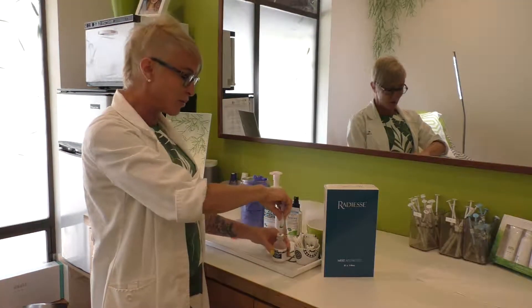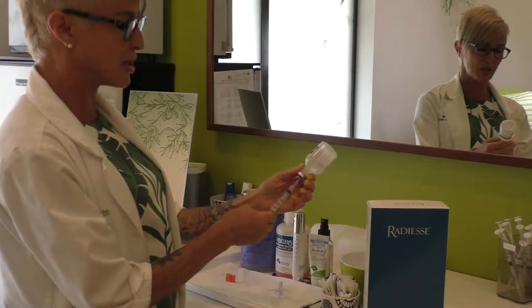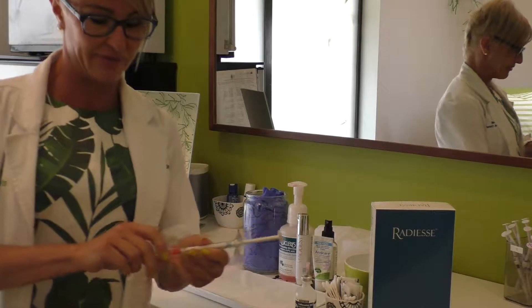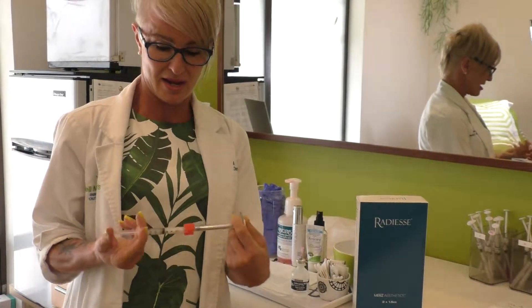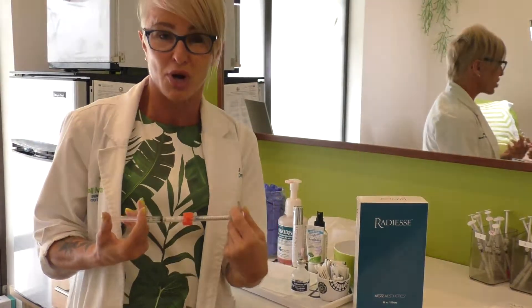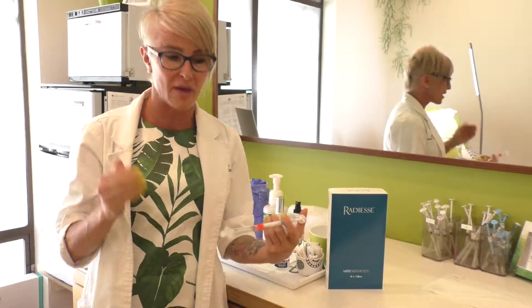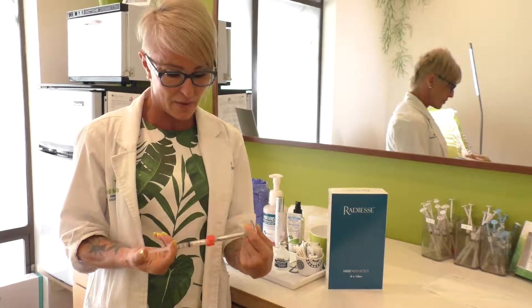I'll mix it by adding a very small amount of lidocaine — about 0.1ml — into the Radiesse using a mixing kit. You attach a female-to-female luer lock and mix it back and forth. With just a small amount of lidocaine added, you have a thicker product that's great for temples and cheeks in a classic liquid facelift, where we lift the lower face by gently plumping the upper face. If you add a bit more lidocaine, you can thin it down for use in other areas lower in the face.